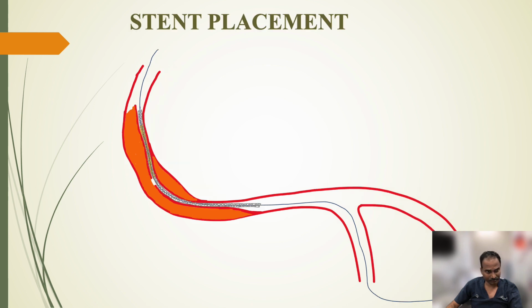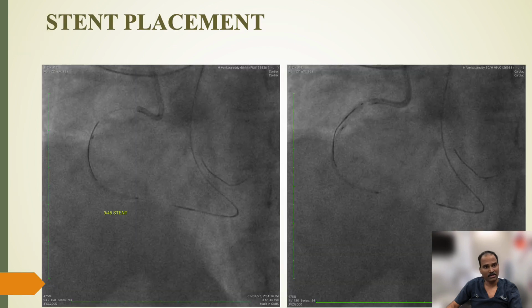So this is a fenestration. There is a long fenestration created here, and now when you stent this vessel, position the stent like this, and then what we have to do is, before we deploy the stent, keep another balloon here and occlude the vessel. So now this intramural hematoma or intramural collection is separated from aortic pressures. So when you try and deploy this stent, all this will flow back into the true lumen. So that is what we did.